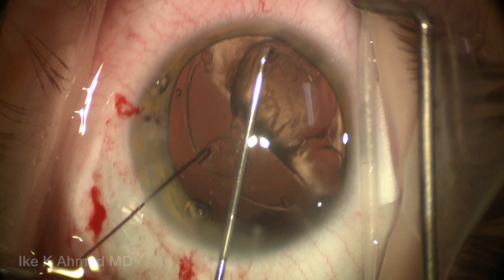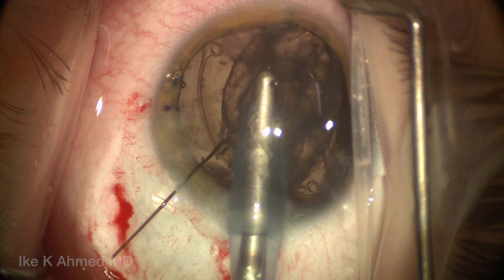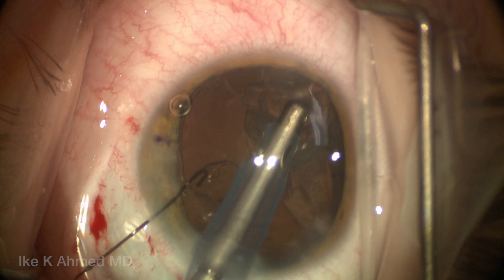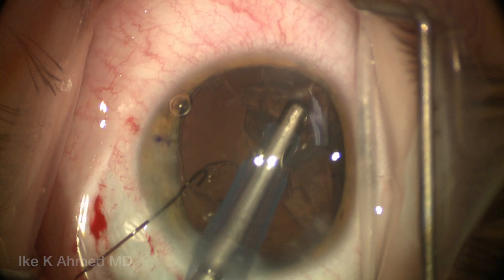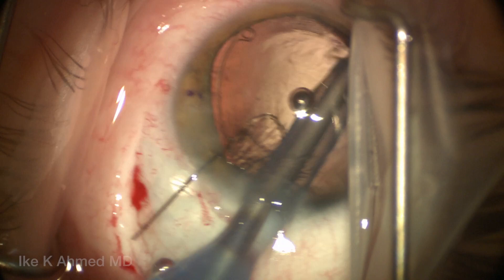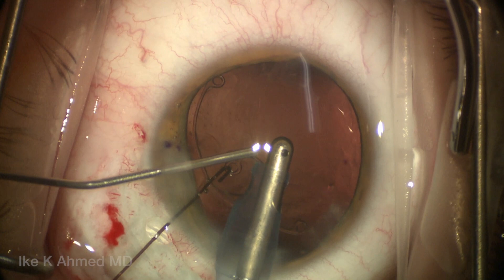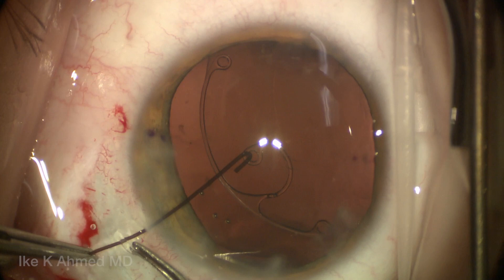We're avoiding excessive tension. Some hydrodistraction is performed and then we can proceed with aspiration using the I&A handpiece. This is essentially a clear lens in a young patient, so we're aspirating out the cortex. Note that we have not placed a CTR yet, because we had adequate support with the CTS in place and will put the CTR in later. We carefully remove all the cortex, ensuring the bag is completely evacuated. It's easier to remove cortex with the segment in place versus a CTR, which can trap cortex behind the device itself. Before coming out, we inject cohesive viscoelastic to prevent the chamber from shallowing and prevent vitreous prolapse — absolutely critical. We add more dispersive in addition to the cohesive to coat the area of the dialysis.